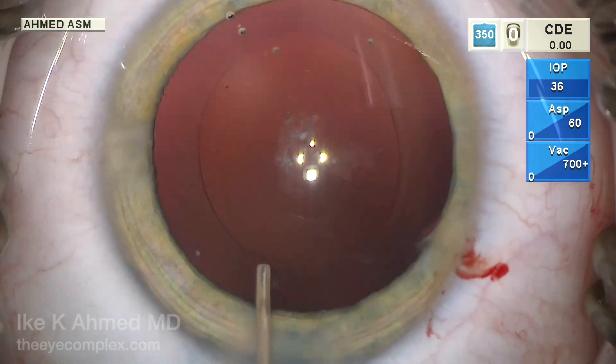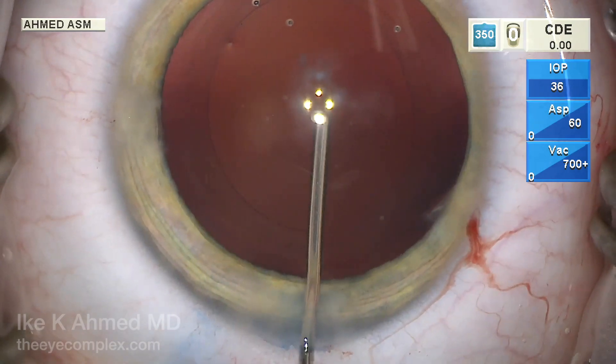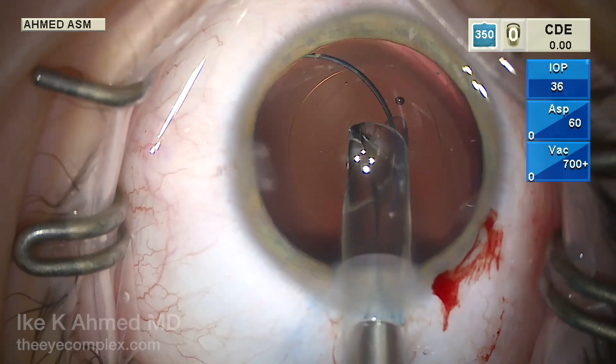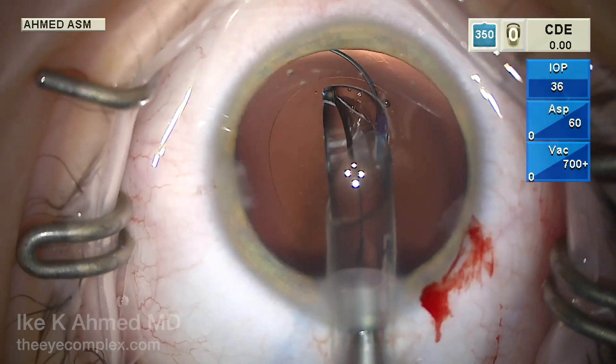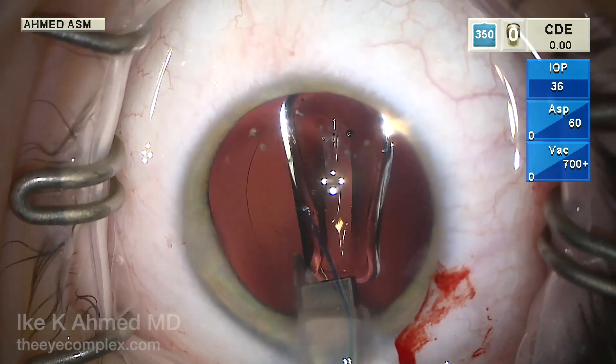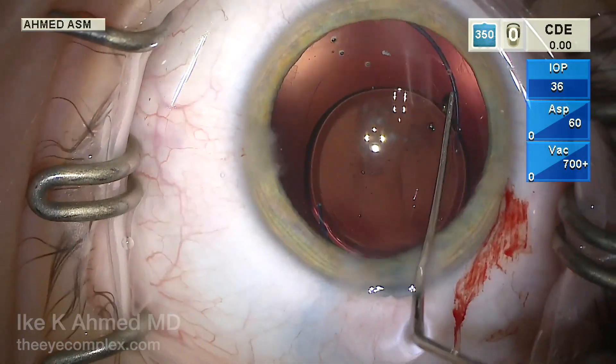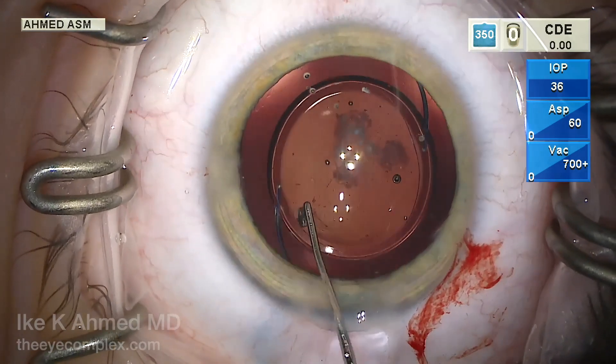We're now ready to place the lens in the capsular bag, which we will do after injecting viscoelastic. I'm using a three-piece hydrophobic acrylic lens here. The reason for this is that we are going to place this lens in a posterior optic buttonhole approach, and this is easier than a one-piece lens, although we have certainly captured one-piece lenses as well.